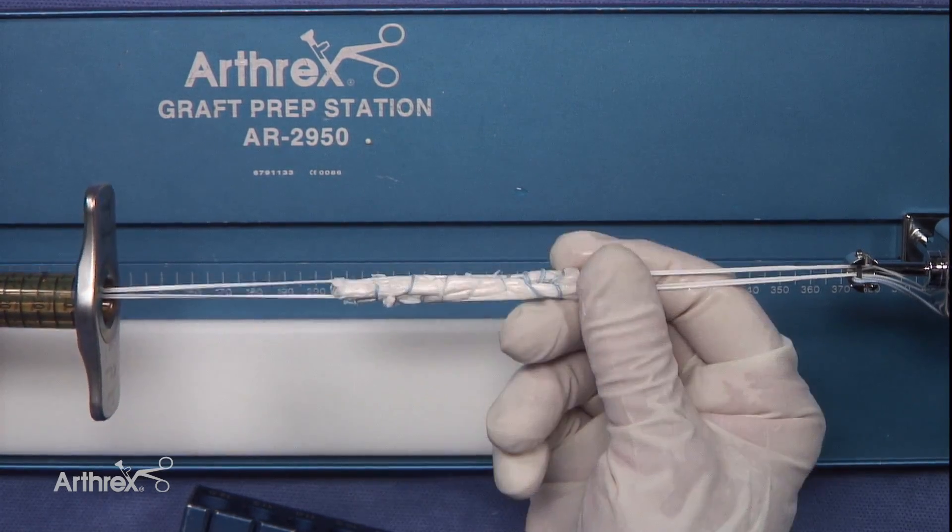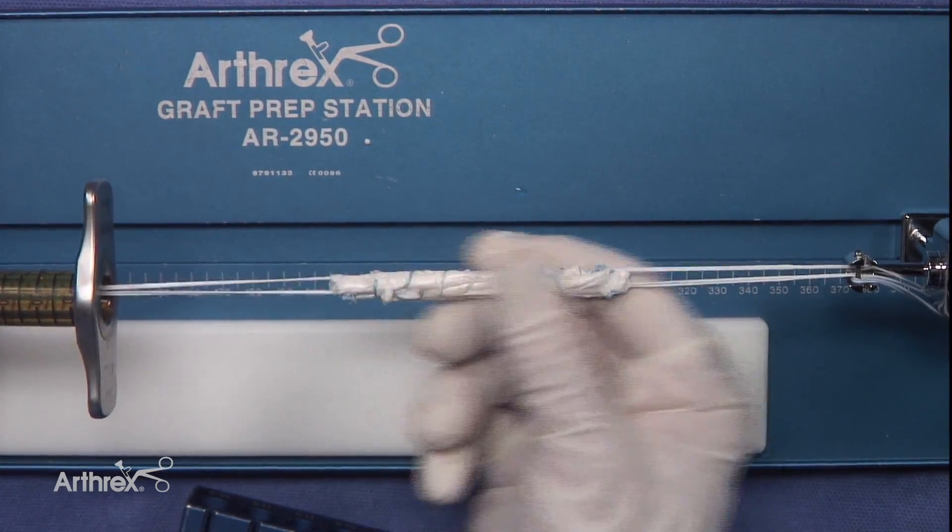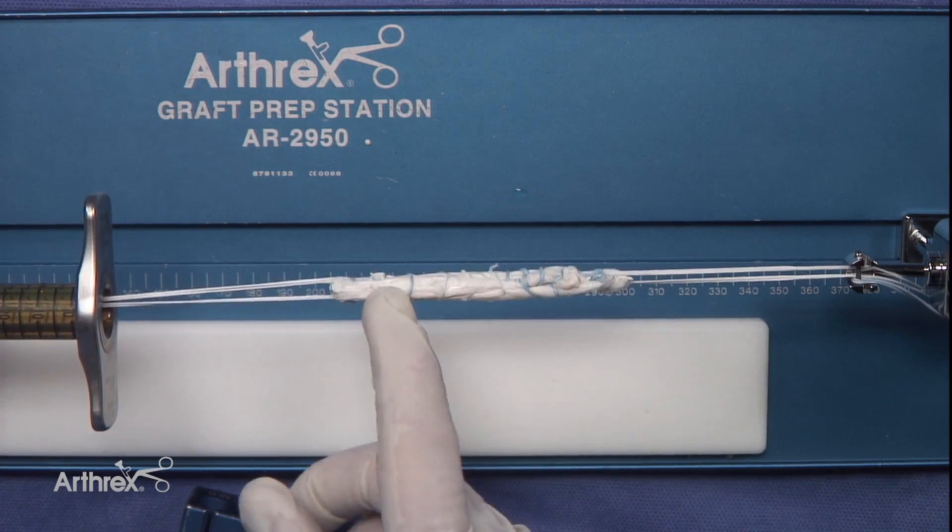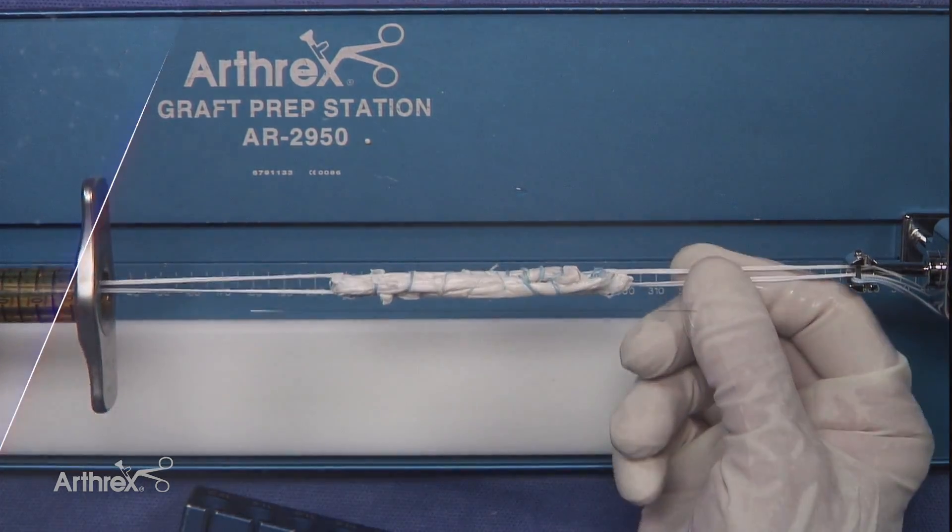In summary, we've simply done a six strand graft by looping it through three times and then using our suture fixation at both ends of our tightrope.